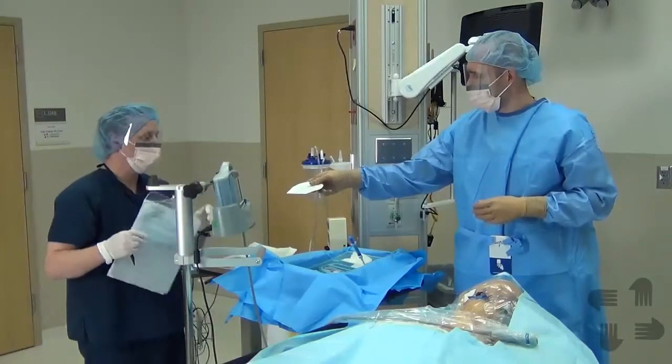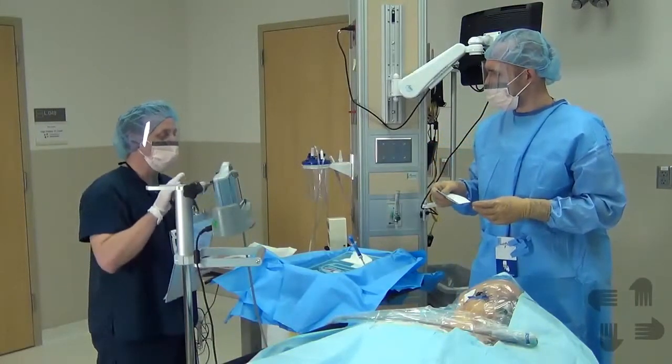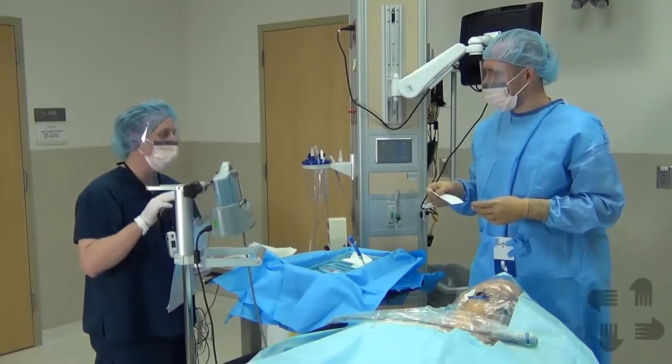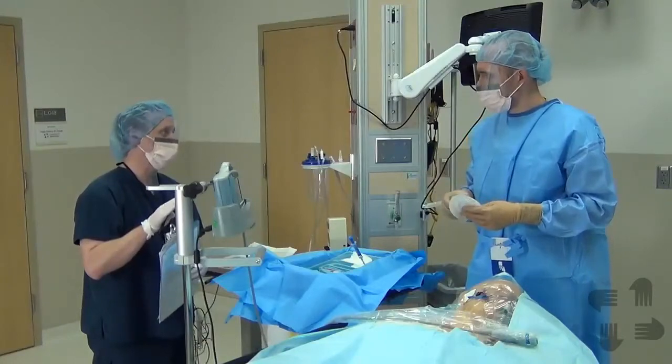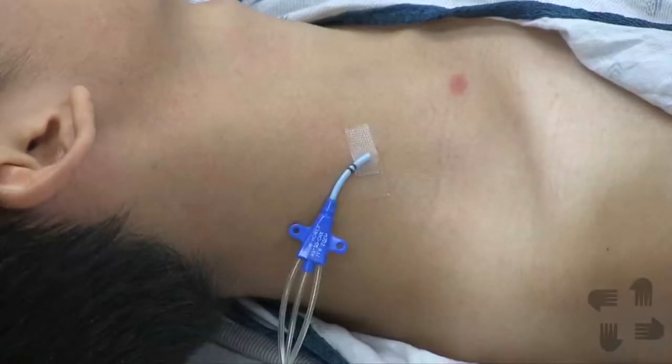Actually, since it's still a sterile field, it really should be you that puts it on. Otherwise, I'd have to gown up, and we're wasting a lot of supplies. I can guide you through this, but I think it really should be you that places this. Okay, just walk me through how to do this. So now that we've placed the line, it's time to dress the line.